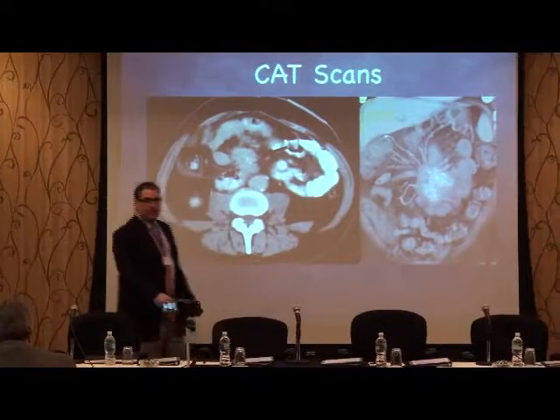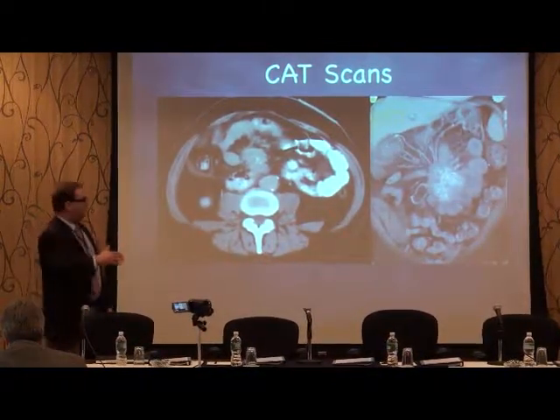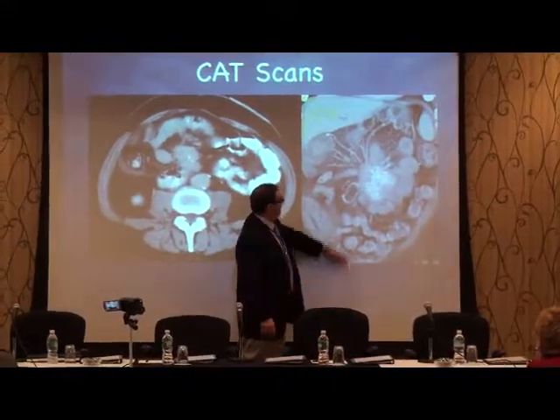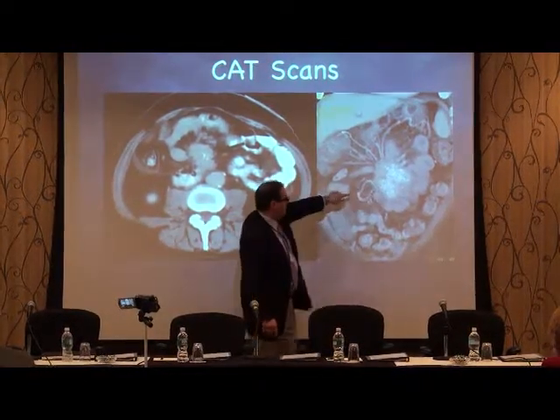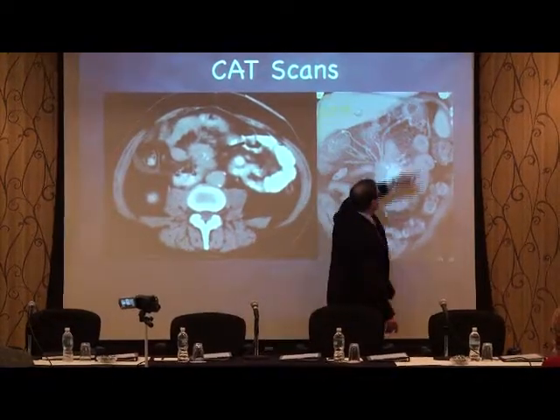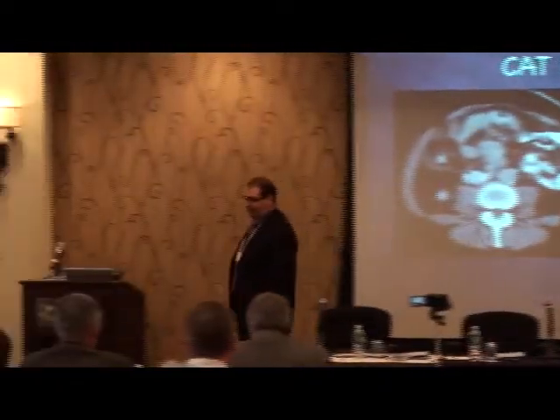The picture next to it, that's our coronal image where it cuts from the front to the back. So here's the top, here's your bottom, and you can see here this large soft tissue mixed density. This is some contrast mixed in with soft tissue. That's tumor. Up here is your liver, up there is your spleen, and this is a very powerful tool, the CAT scan.